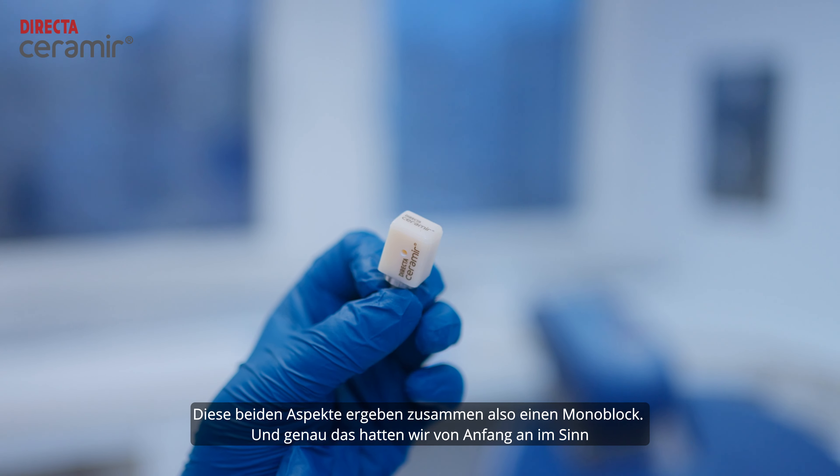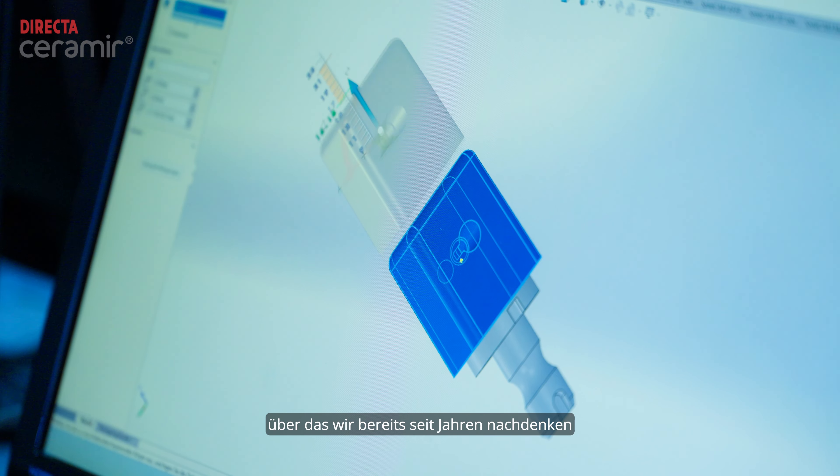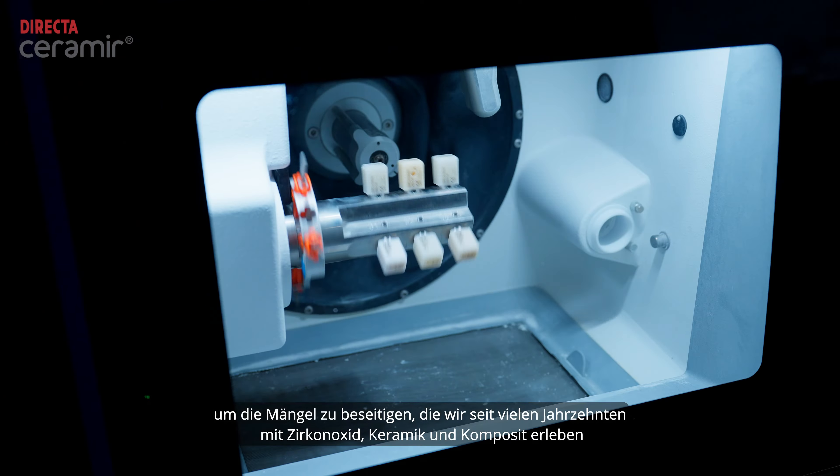So together with the tooth, it's a monoblock. And this is what we have had in mind from the very beginning — this is what we wanted to achieve. But we had to invent the manufacturing process to treat the material, to get it where we had it in our heads already, to overcome the shortfalls which we have experienced over many decades with zirconia, with ceramic, and also with composites.